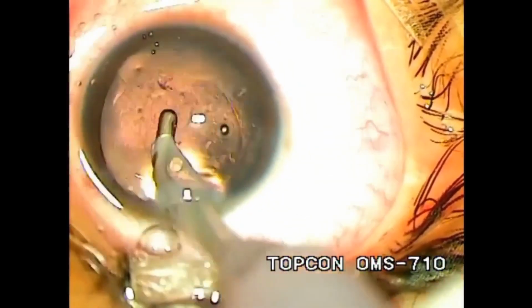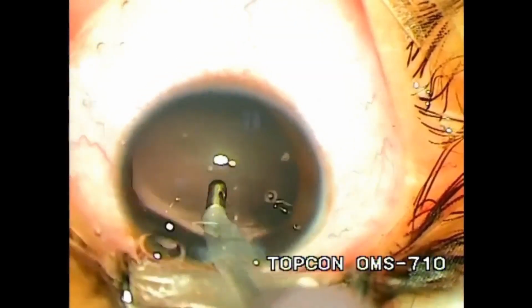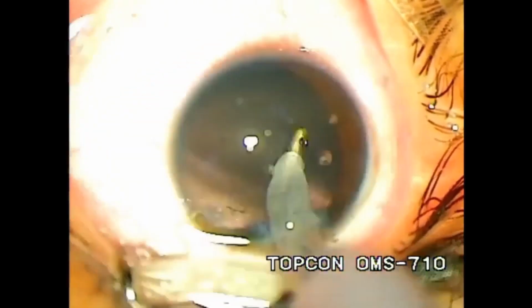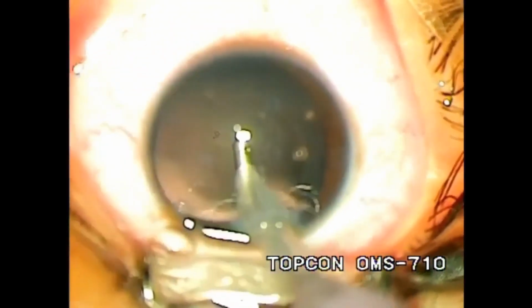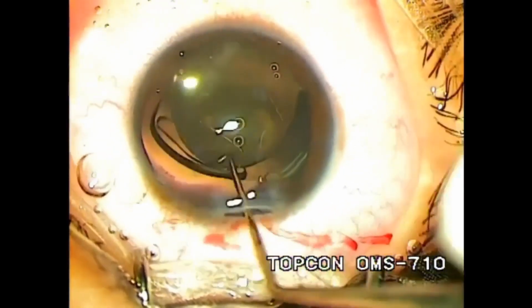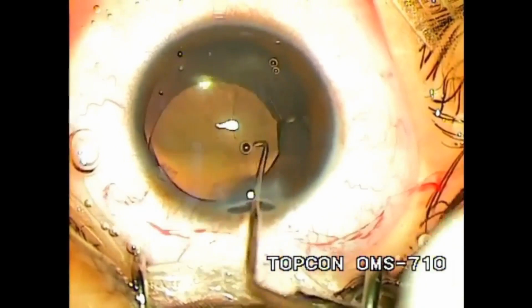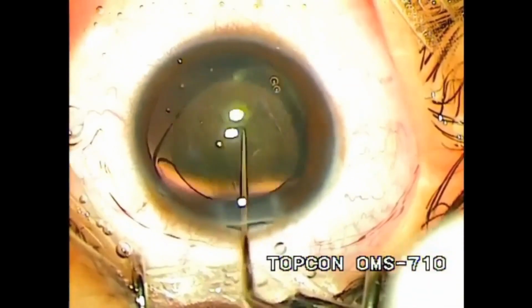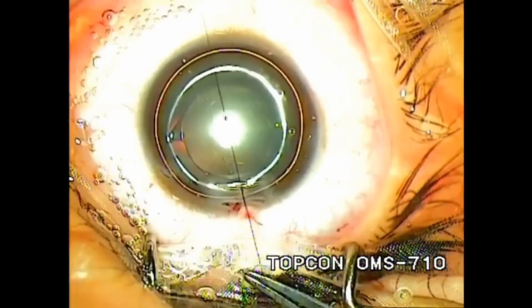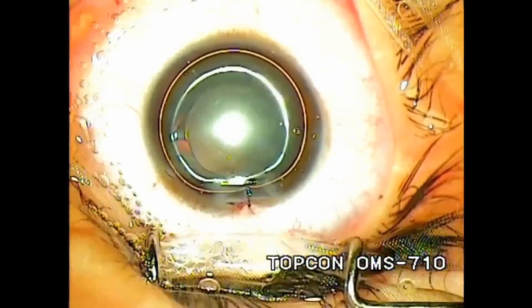Posterior lenticonus on biomicroscopy is a localized conical projection of the posterior capsule and the cortex, usually present in the visual axis, and rarely it could be present eccentrically. Posterior lenticonus arises in infancy and can progress throughout early childhood. Development of amblyopia is the most significant visual deficit in a case of posterior lenticonus. Except for amblyopia, the final visual results after surgery were good.